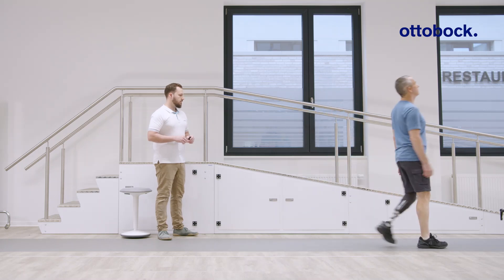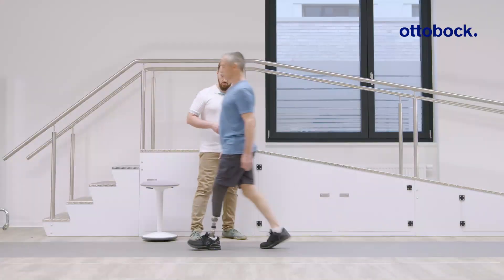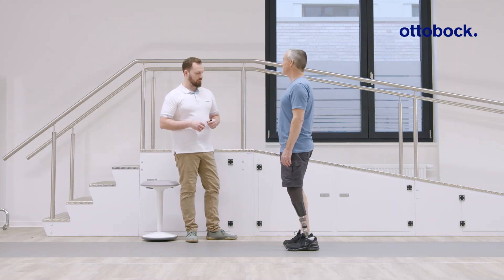Monitor the use of the hydraulic range of motion by observing the angle indicator lines. Remember that further fine-tuning of the Taleo ADAPT's behavior can be achieved by changing the heel wedge.